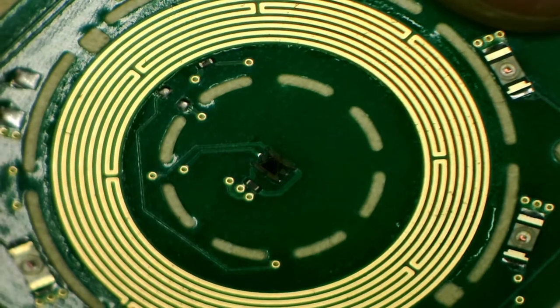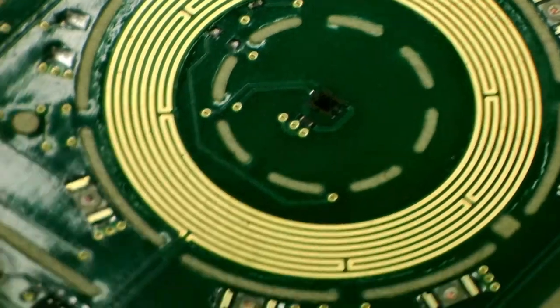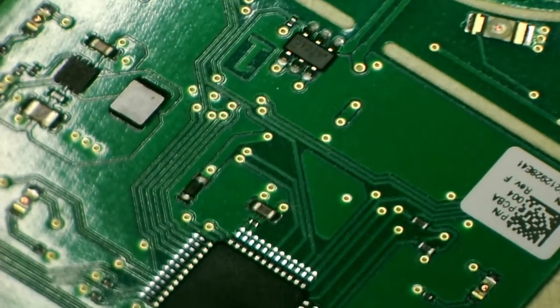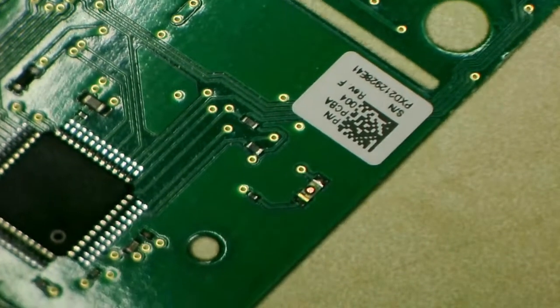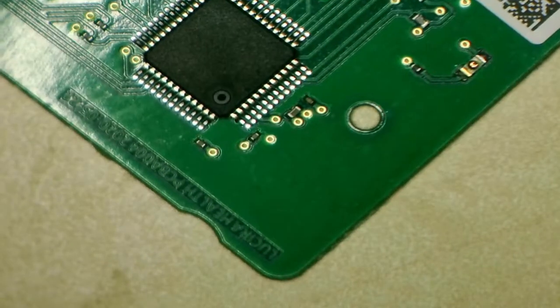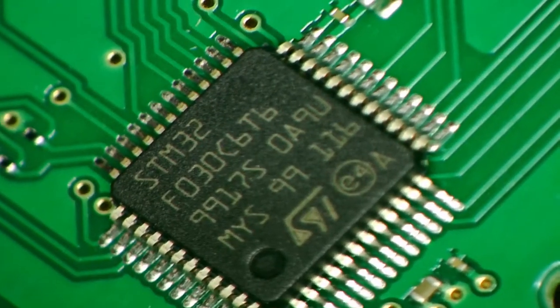Okay, so I've just put the circuit board under the microscope, and you can see here's the big circular area, which I'm now pretty sure is the heater. And then if we move it over a bit, here's really the control section of the circuit board with one big IC and a few smaller helper ones, as well as some LEDs, like the one I'm moving to in the center here, which would be the indicator LED saying whether you're positive or not. And when I tilted the circuit board a bit in the right way, we could actually read the part number off the IC, and I'm pretty sure it's a very standard part. And there we have it.